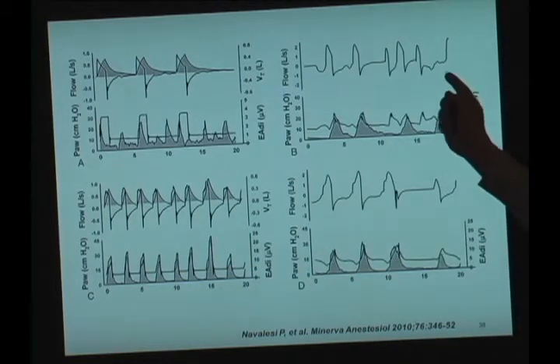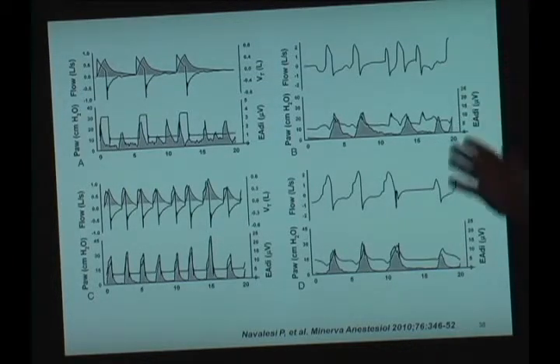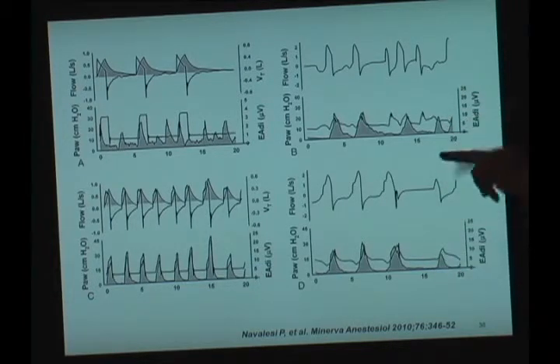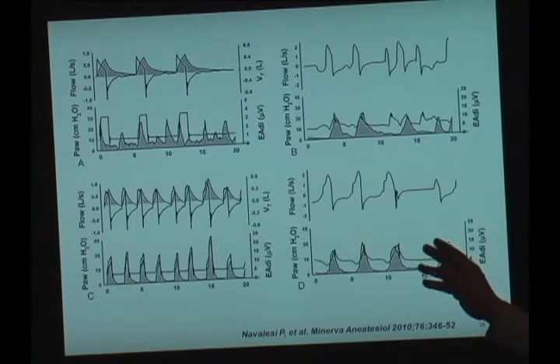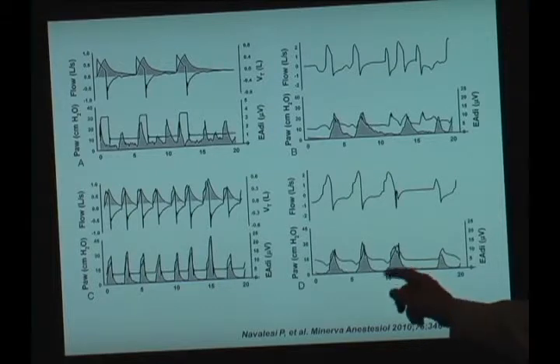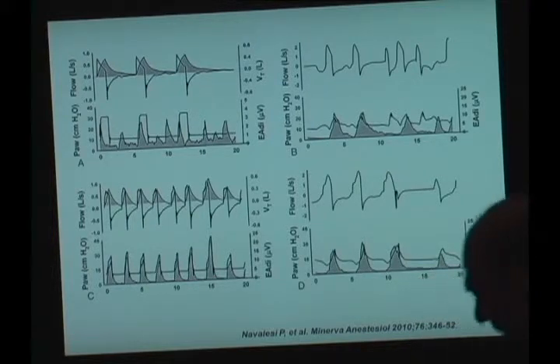The same happened during non-invasive ventilation. This is helmet ventilation, pressure support, and NAVA ventilation in the same patient after the switch. So the message is NAVA is not only a monitor to see what's happening in the diaphragm, but it's also a modality to try to decrease asynchrony and to try to follow the patient more properly.